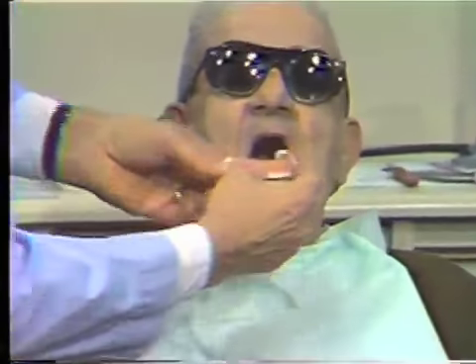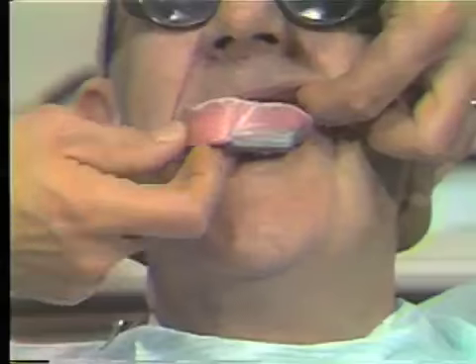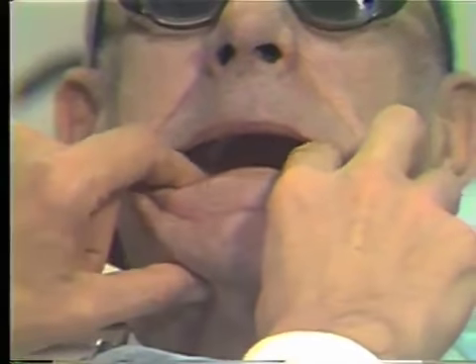The lower rim has been lubricated and will be placed in the mouth. Maxillary rim with the soft wax will be placed in the mouth. And now it's important that the patient close the two rims together in this most retruded position.